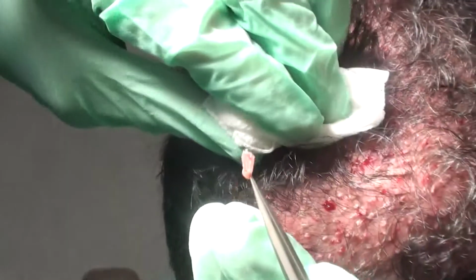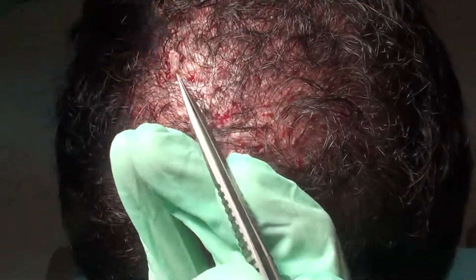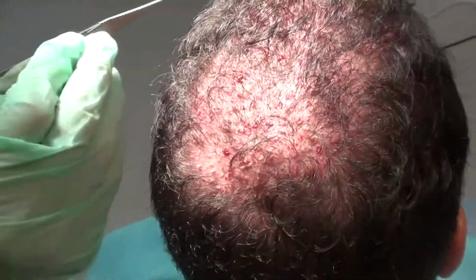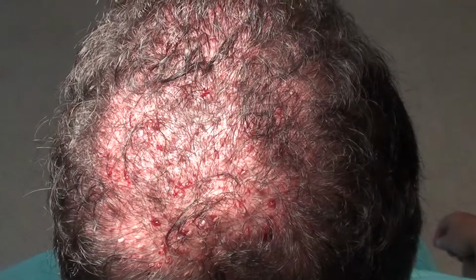Now a lot of people are saying, oh well, that's a plug. That's not a plug, that's a slit graft, okay, that went into a tiny little slit, and that's the way it came out naturally. So this is the way it's going to go back in. This is what Mother Nature did. We don't want to take these tiny 1 hair grafts that we use in the front for the softness and the naturalness in the crown area, because we want to help achieve more density for the patient.